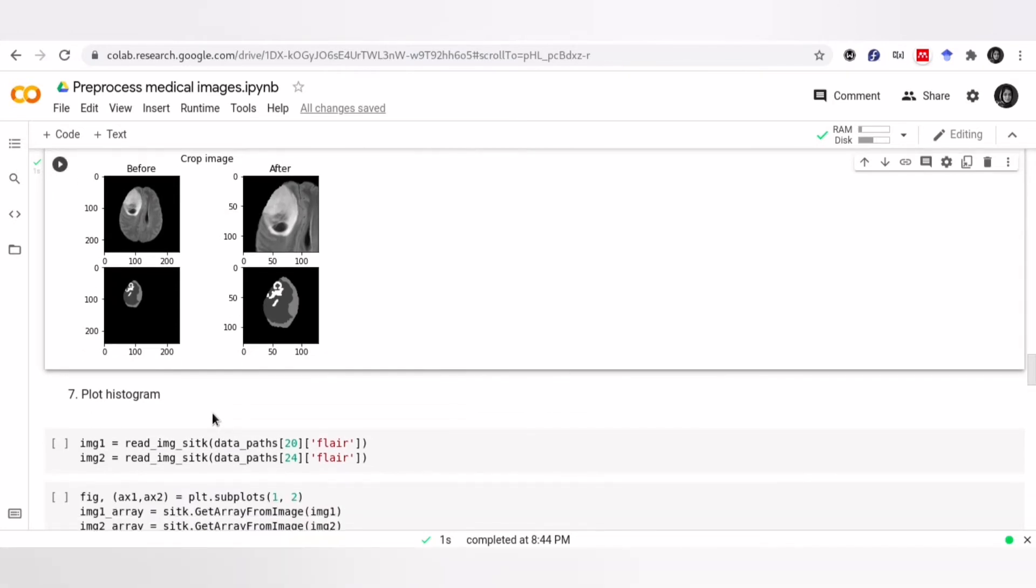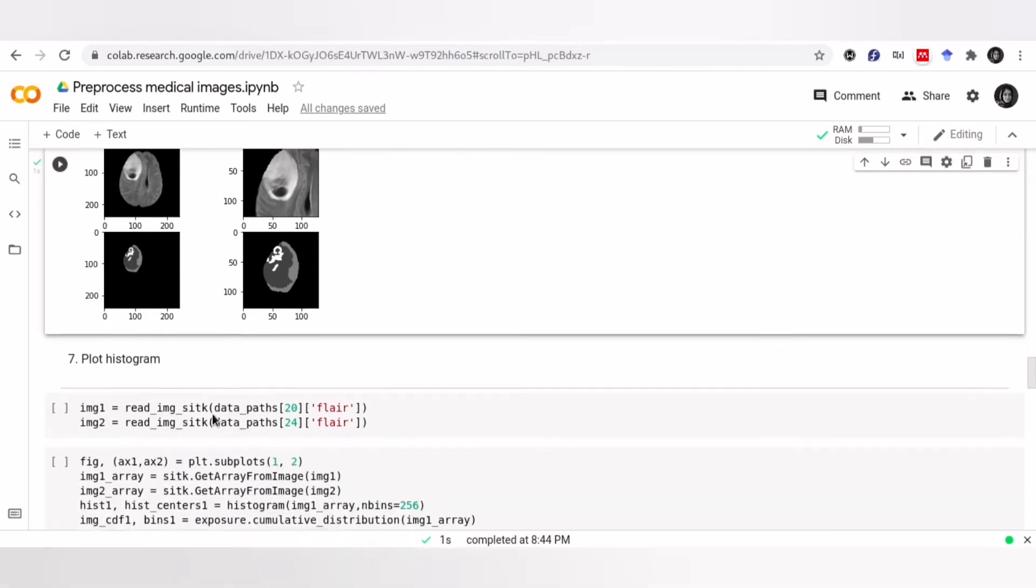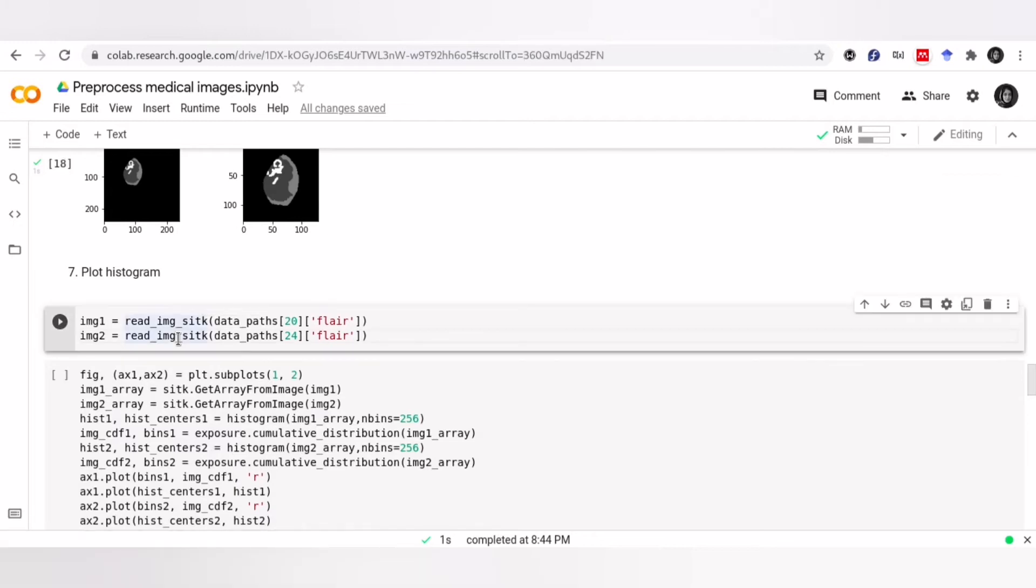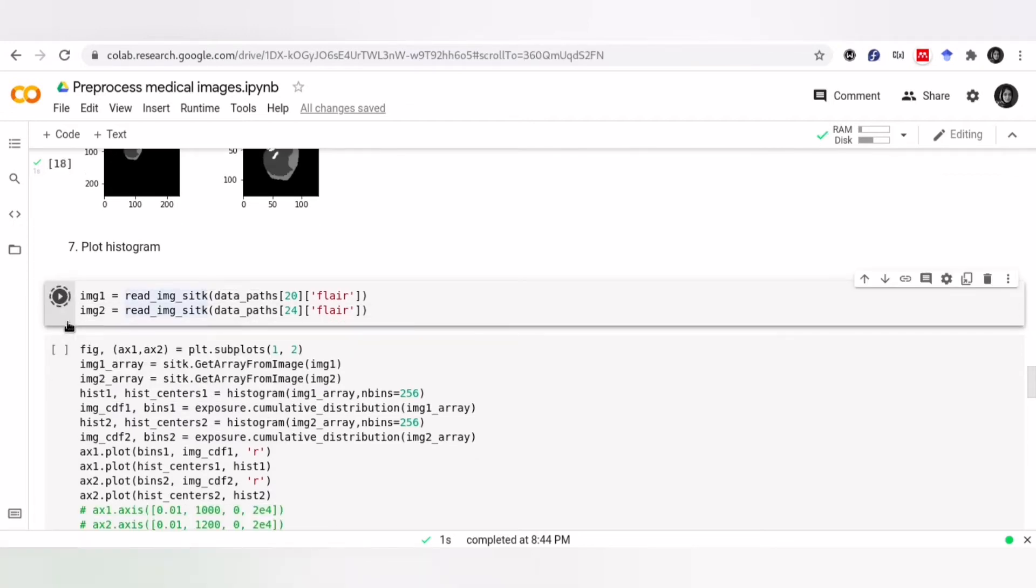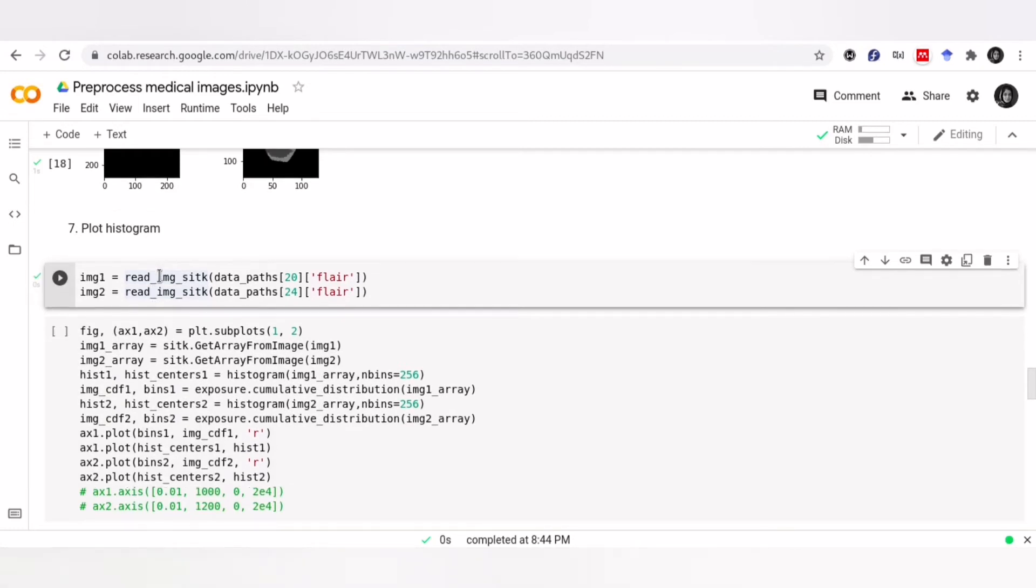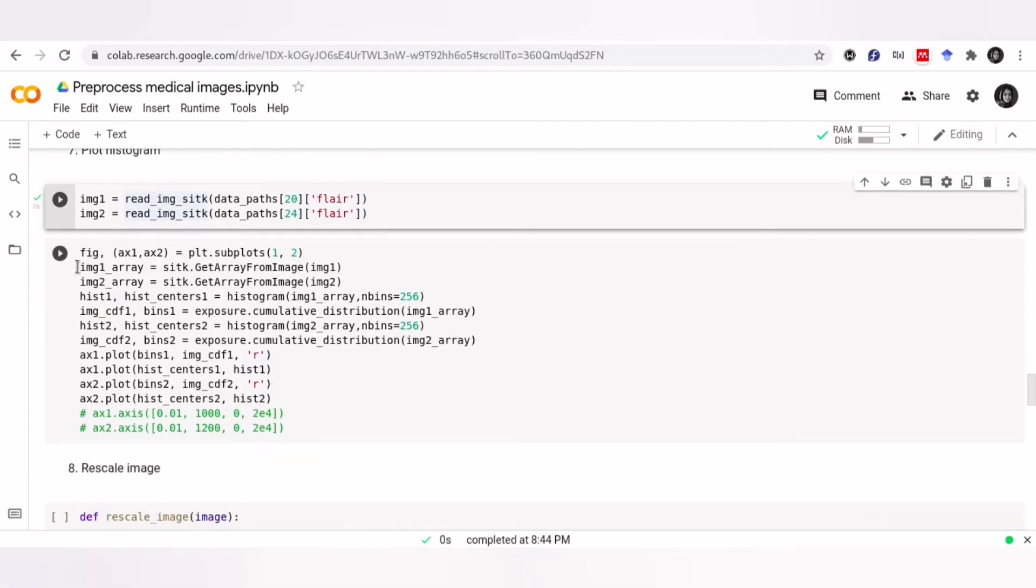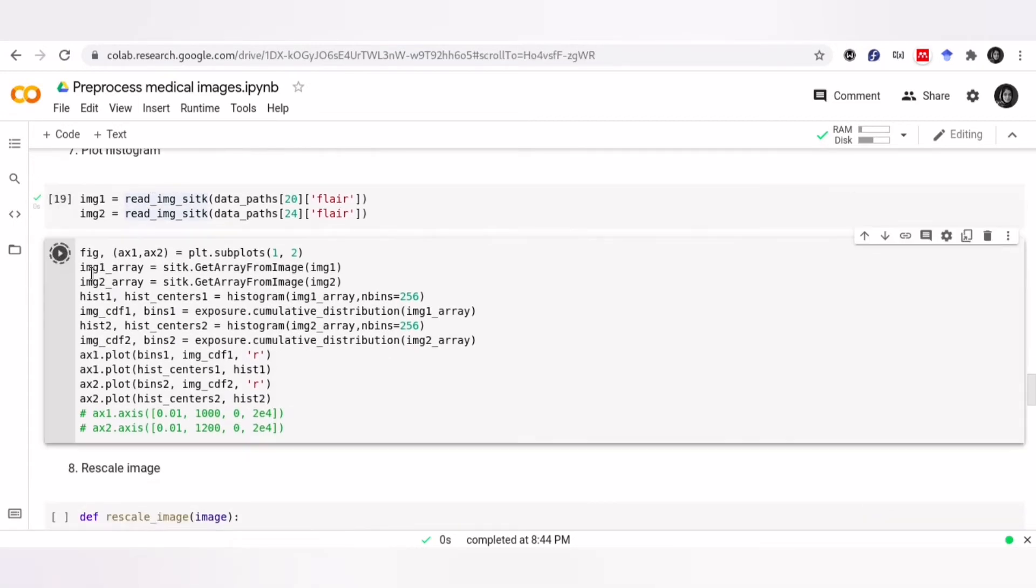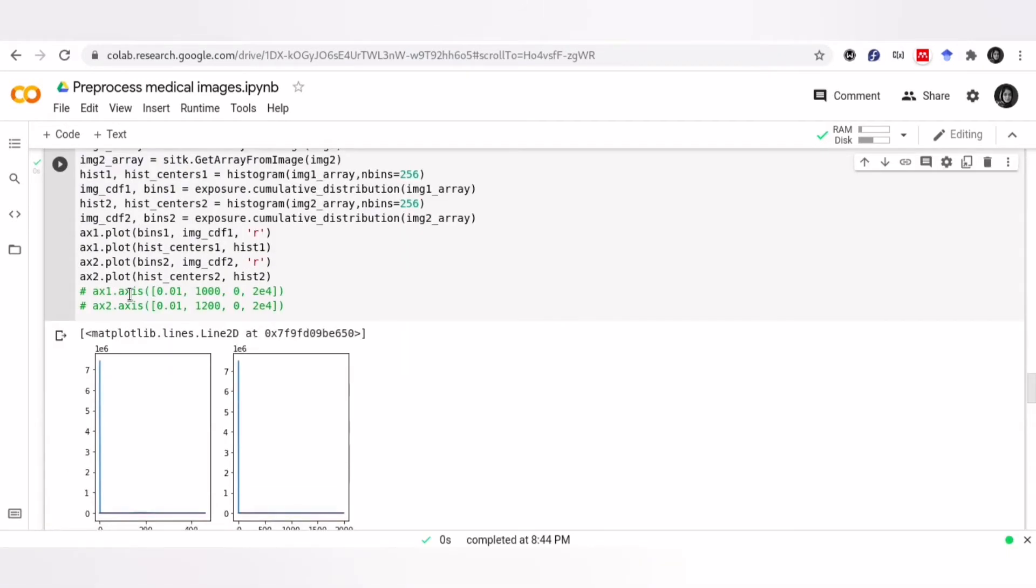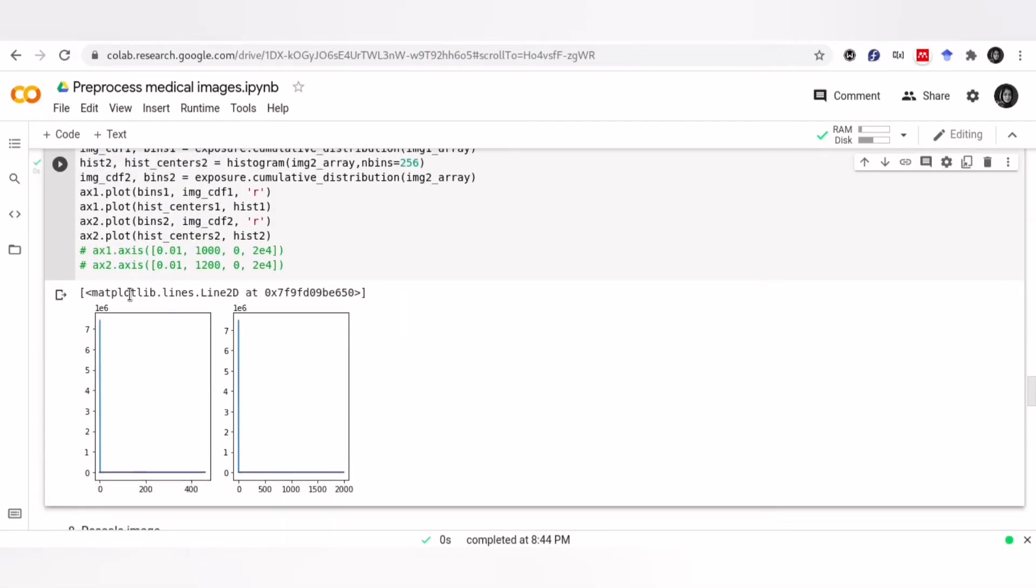Before I talk about rescaling images, let me show you the histogram of two images in our dataset. This helps you to understand why do we need to rescale images. As you can see, our images have different scaling.